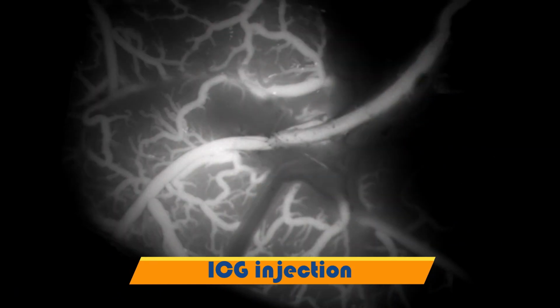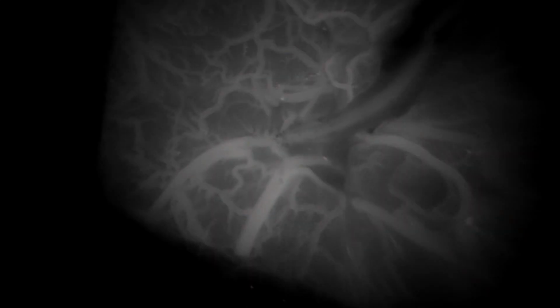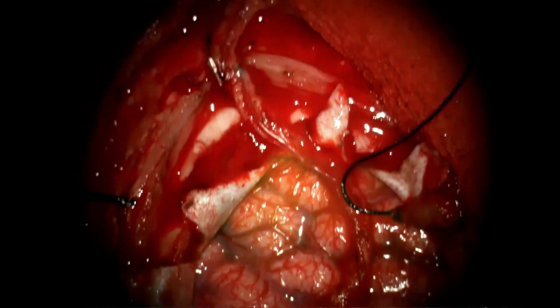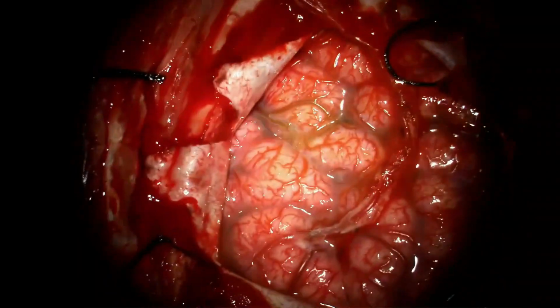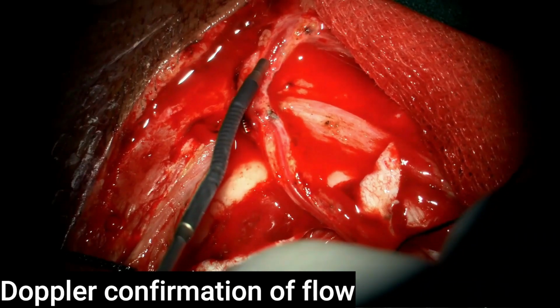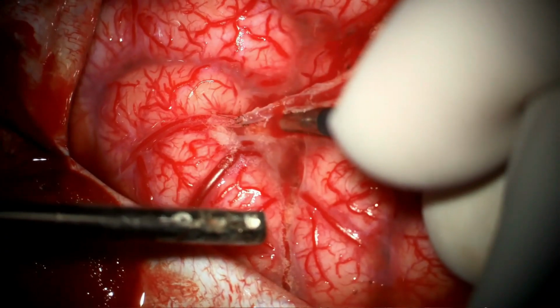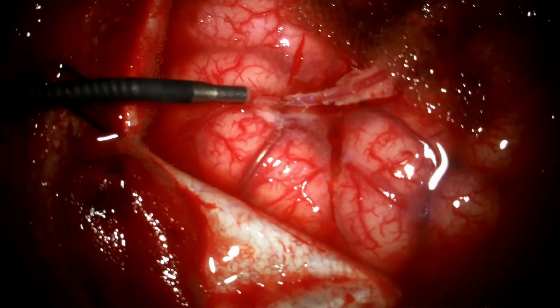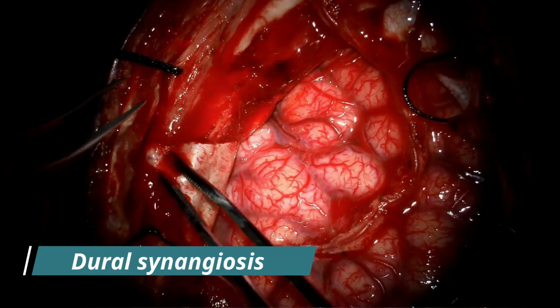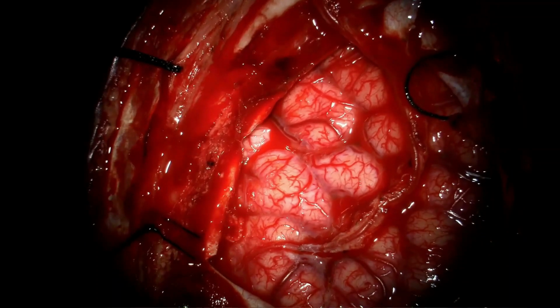After releasing the STA temporary clip, flow is confirmed on ICG injection. Flow is noted even from the proximally exposed STA segment. The direction of flow is again confirmed using Doppler. Dural synangiosis is performed by inverting the dura on the cortical surface.